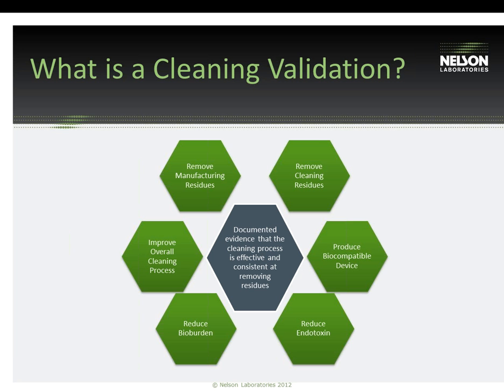Along with this definition, there are some goals and purposes of a cleaning validation that we also have listed here that are important to consider. Are you removing those manufacturing residues, the cleaning residues? Are you producing a biocompatible device? Also, you want to reduce the amount of microbiological contamination present, such as bioburden or endotoxin. And finally, are you just trying to improve the overall cleaning process? A lot of people may want to implement a change or a new step in the process, and these cleaning validations can help you decide after you've sent your benchmark data if those changes are beneficial to implement or not.